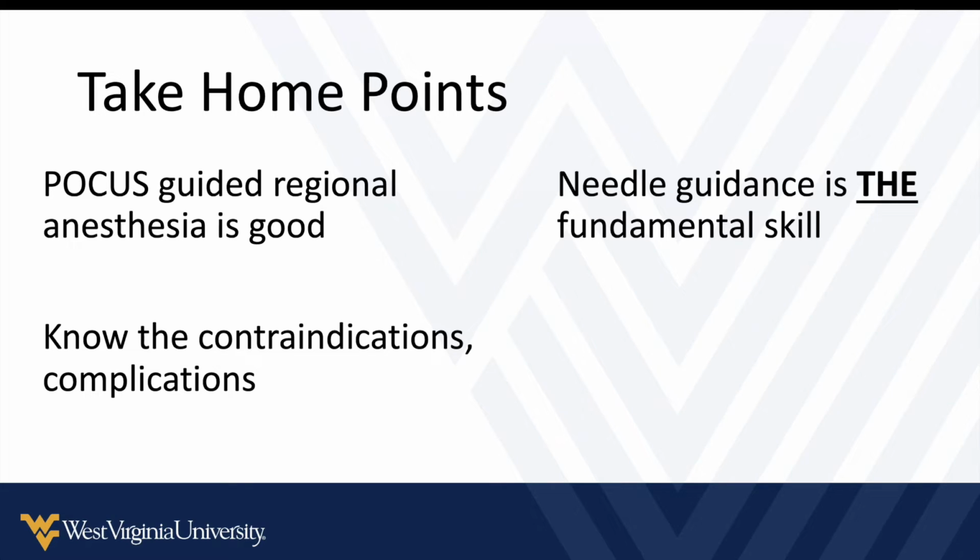If you are good at guiding a needle, then you can learn or refresh yourself on some anatomical landmarks and findings and adapt that to any of these procedures. That's why, with some of our other topics we've talked about, guiding a needle is the most important thing. If you're very skilled at ultrasound guided peripheral IV insertion, then you probably can do this fine, especially if you can do an in-plane technique. So that's a very important skill.